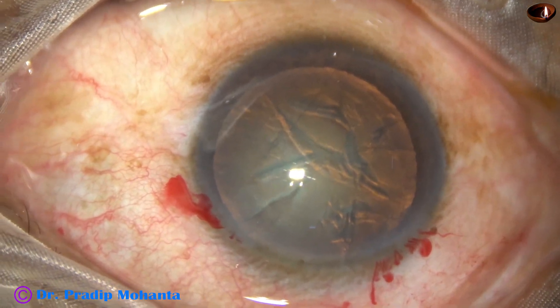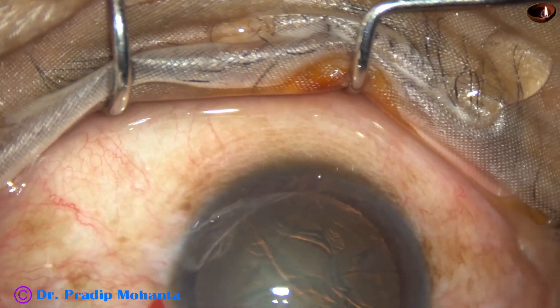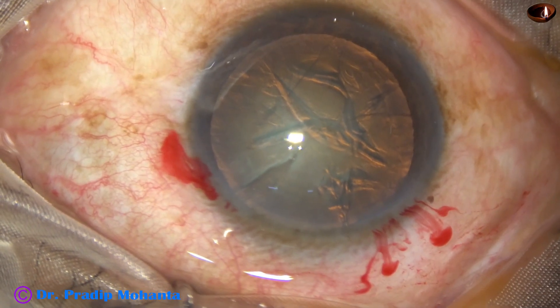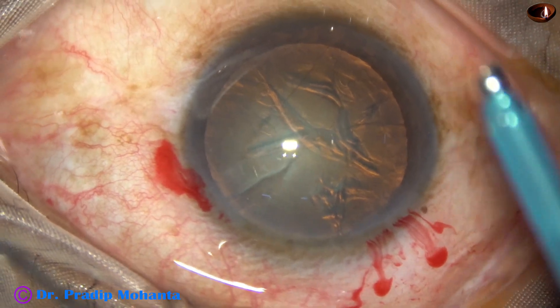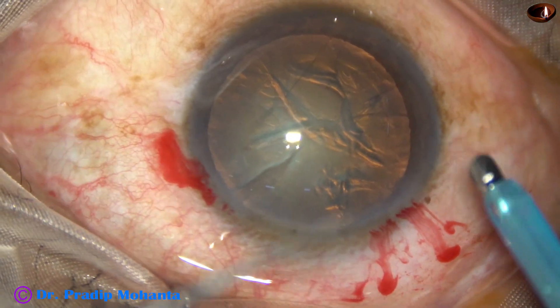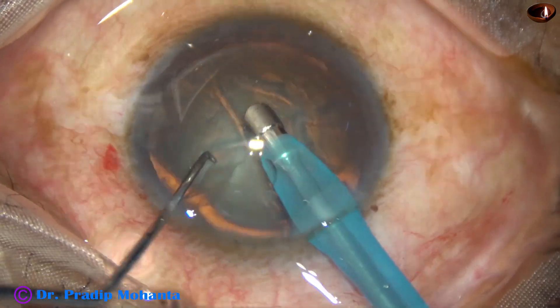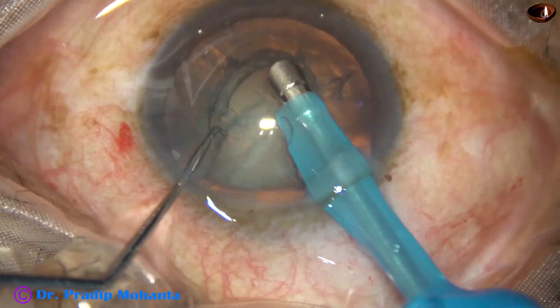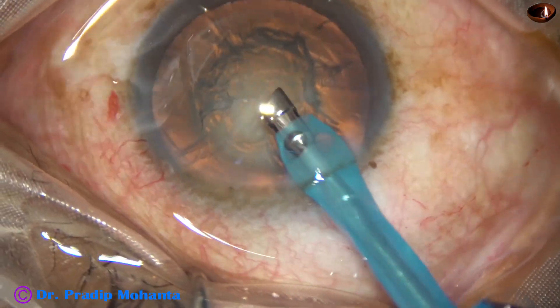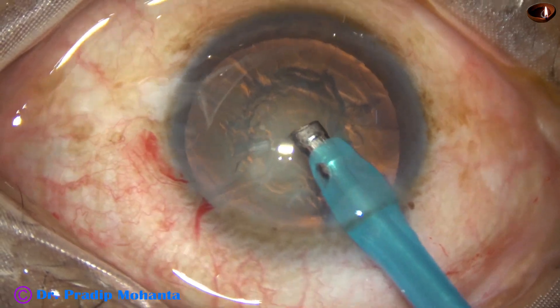The anterior chamber is again filled up with 2% HPMC. The settings are: vacuum 80 mmHg, flow rate 25 ml per minute, and ultrasonic energy 60%. The phaco needle goes in, bevel down. Some superficial cortical lens matter is removed, and then the handpiece is turned to make the bevel up. We are ready to do sculpting.